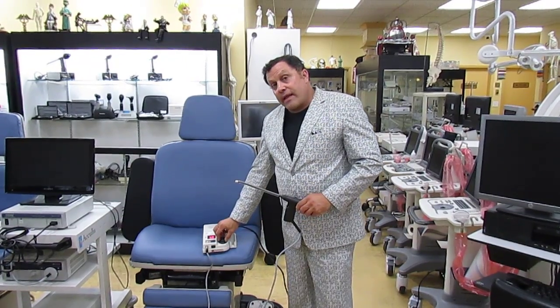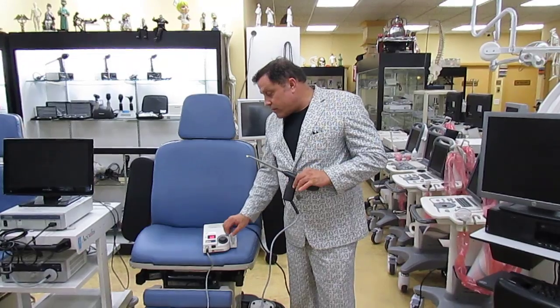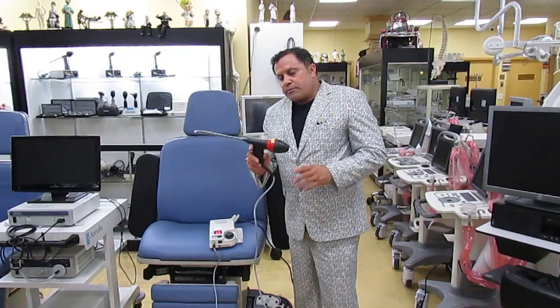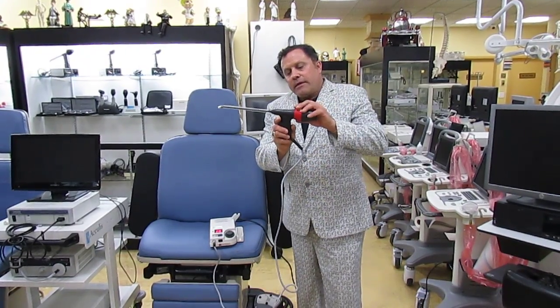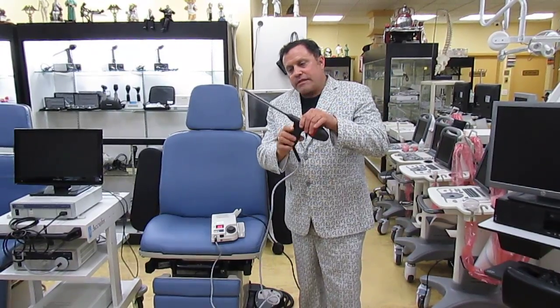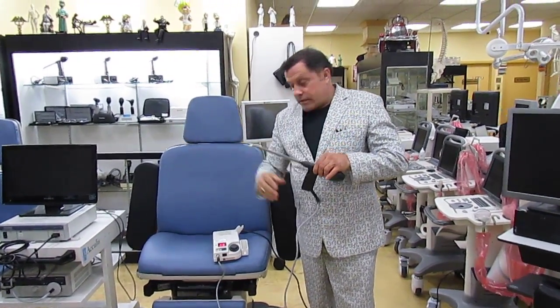That's the IRC 2100. We buy, sell, and repair them — we can't fix every unit, but we do handle some repairs. Inside, there's basically a 14-karat gold light worth three to five hundred dollars, and the tip is fiber optic, which carries the light to the treatment site.